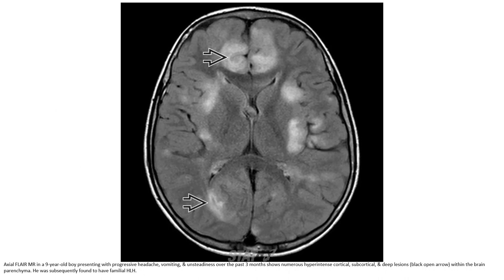Axial FLAIR imaging in a nine-year-old boy presenting with progressive headache, vomiting, and unsteadiness over the past three months shows a number of T2-hyperintense cortical, subcortical, and deep lesions within the brain. He was subsequently found to have familial HLH.